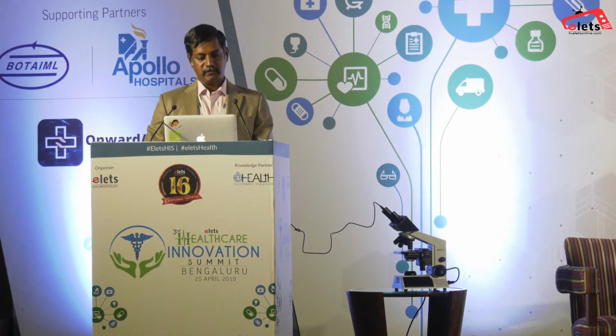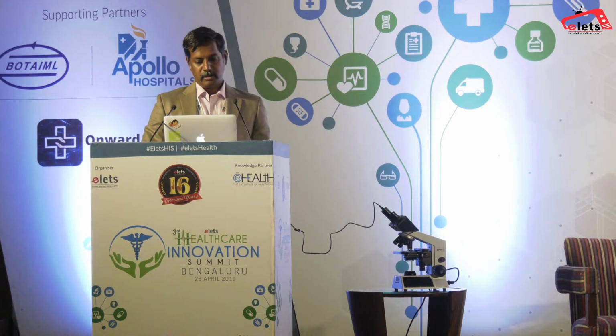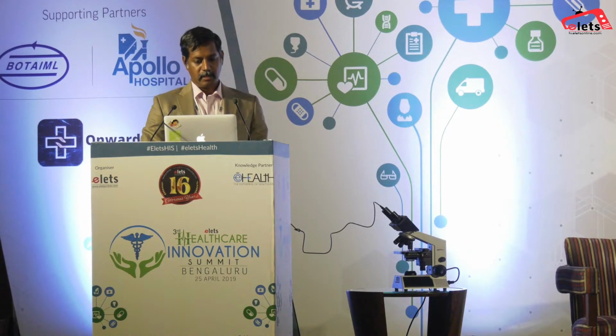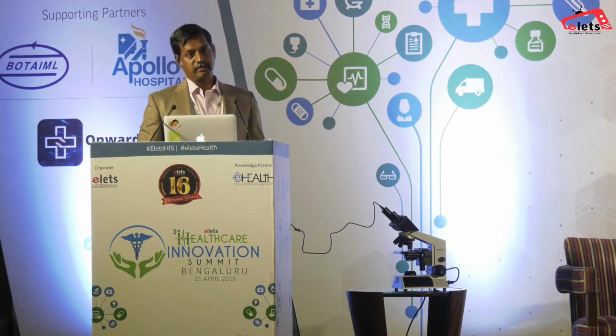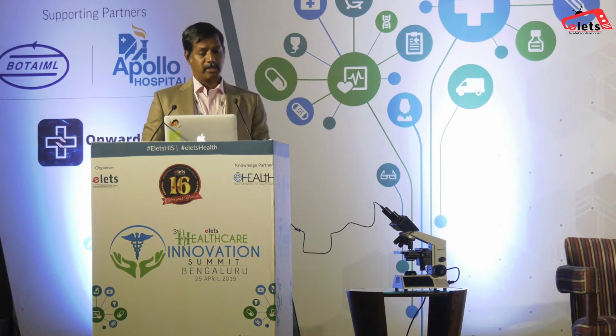It will keep saying waiting for doctor. So at the remote end, I have the hemat technician logging in there and clicking live stream. Here I have the image that's been switched on because I am the technician. I have my slide available locally. I have a microscope, and the microscope is connected to the system through a USB. So I've switched it on since the remote pathologist requested the live stream.